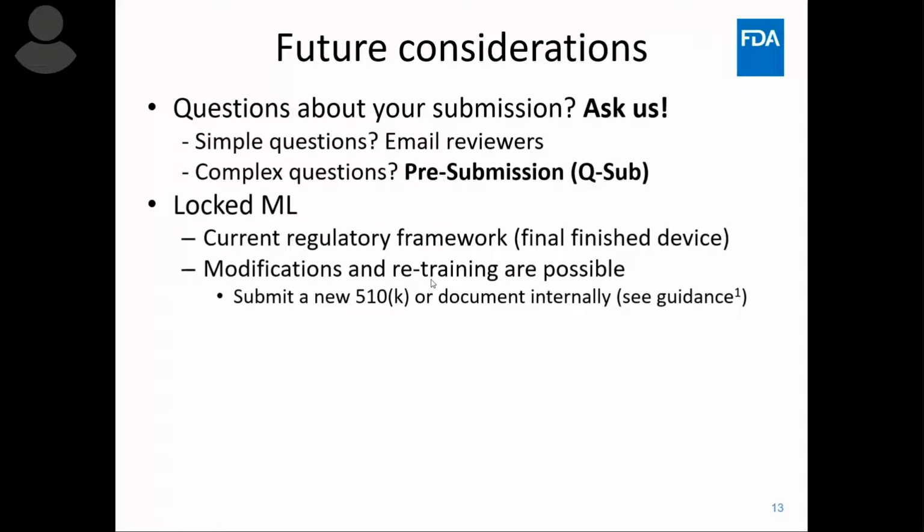I also say that we talk about locked machine learning because that's our current review framework. We usually review final finished devices. So by definition, they're locked. You can modify your device. You can retrain your device. There are guidances that tell you when you need to submit a new 510(k) submission.